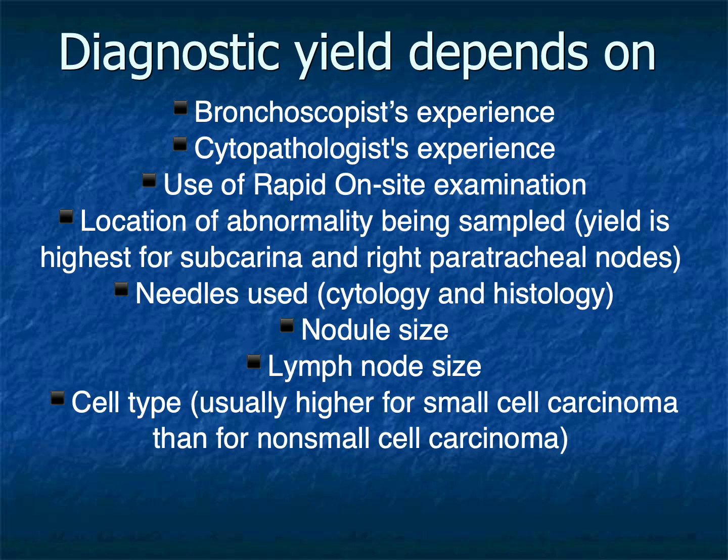Diagnostic yield depends upon several factors. These include operator experience, cytopathology expertise, lymph node location, lesion size, needle selection, and the underlying disease process. Subcarinal and right paratracheal lymph nodes generally provide the highest diagnostic yields because of their favorable anatomical relationship to the airway.